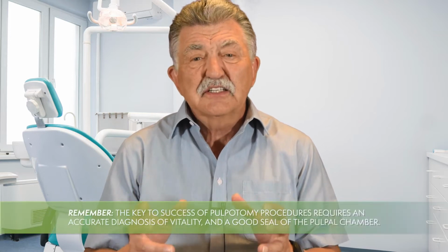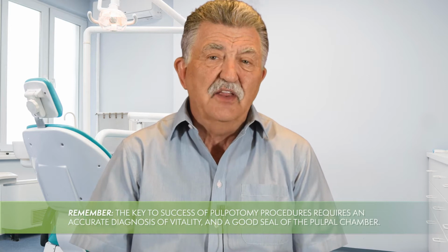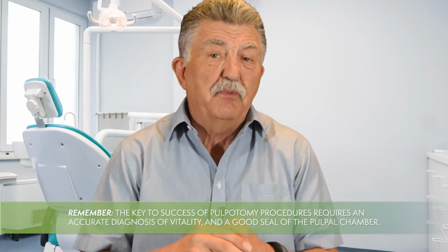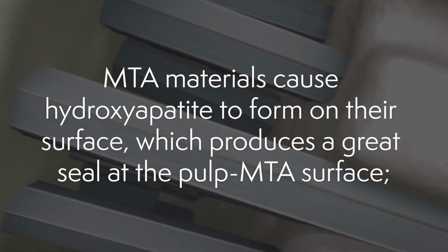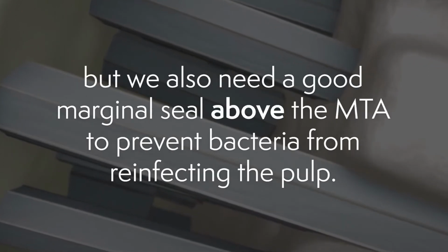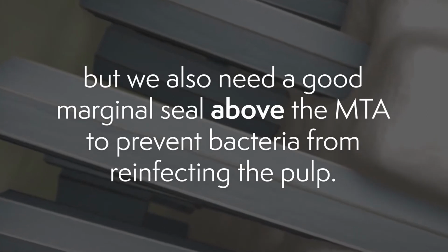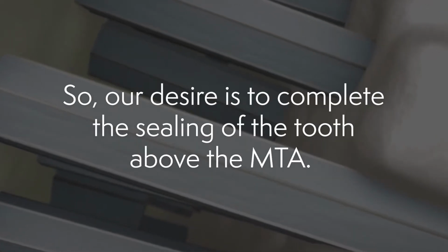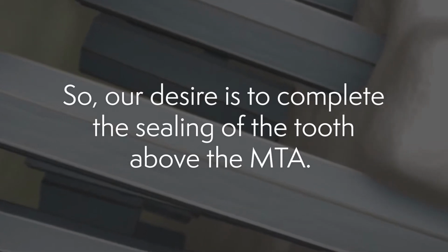Remember that a key to success of pulpotomy procedures requires an accurate diagnosis of vitality and a good seal of the pulpal chamber. MTA materials cause hydroxyapatite to form on their surface, which produces a great seal at the pulp-MTA interface. But we also need a good marginal seal above the MTA to prevent bacteria from reinfecting the pulp. So our desire is to complete the sealing of the tooth above the MTA. Now, back to the original question.